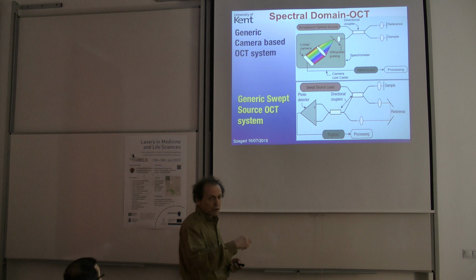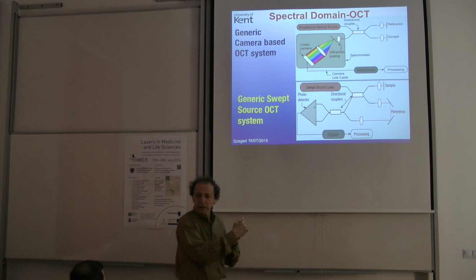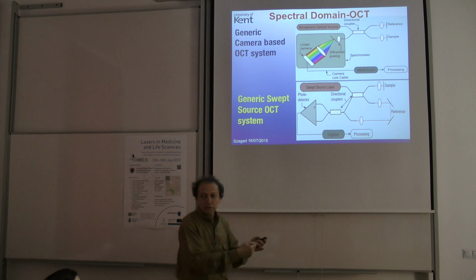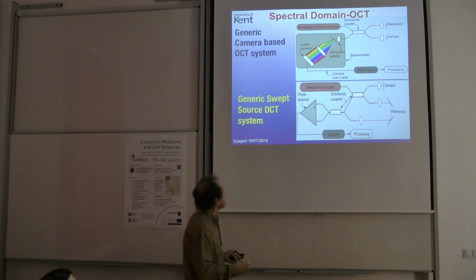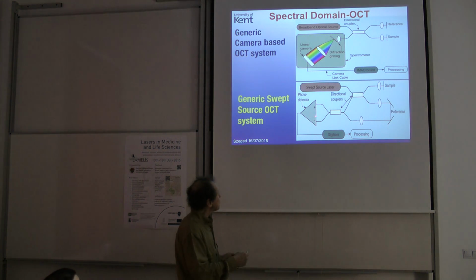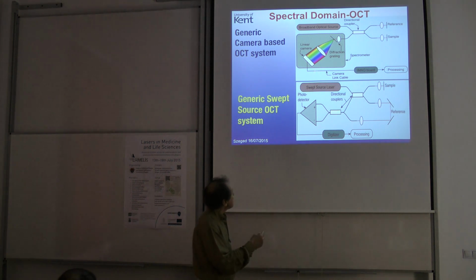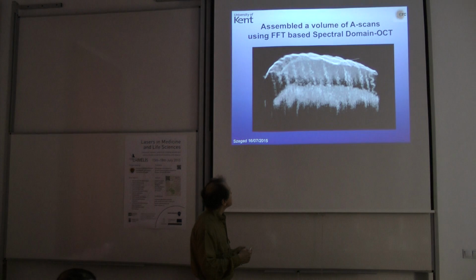So you read it, you have that modulation, and you see how many peaks are in the spectrum. From that number of peaks, you know where the mirror is. If you have several mirrors, like in tissue where you have several scattering centers, there will be a superposition of those modulations, which will come up here. The other technology, swept-source technology, is the same interferometer, but we read the spectrum at the output. From the source we go to the sample and back, from the source we go to the reference and back. Here we superpose those two, and we have two photodetectors here, balanced detection, and again we read the same spectrum, which is displayed here, in these two fibers.